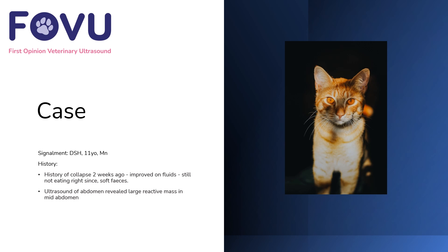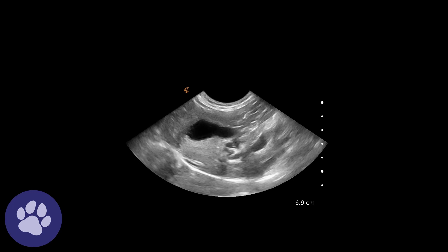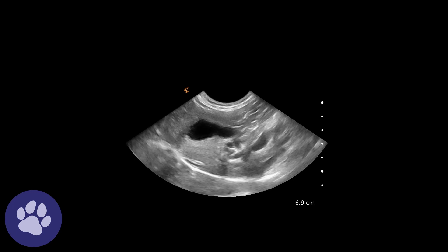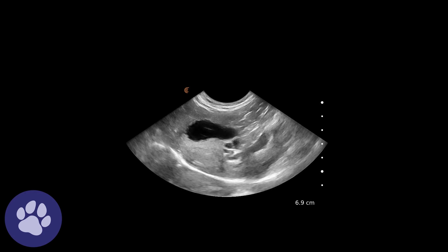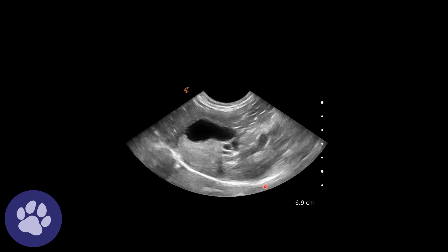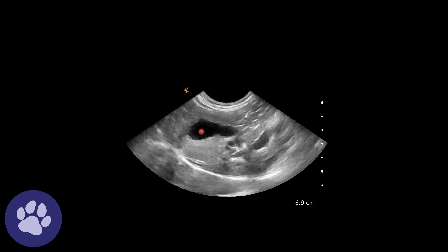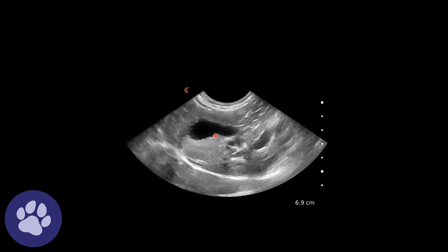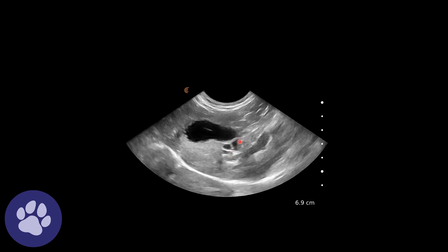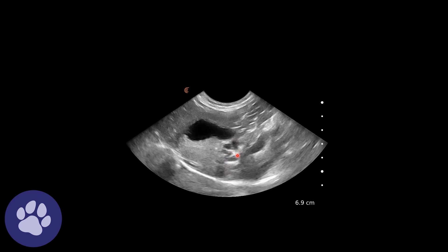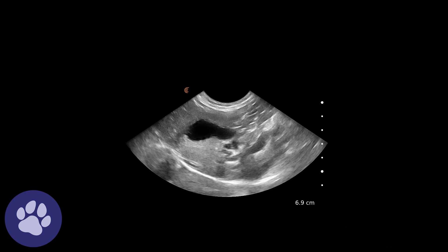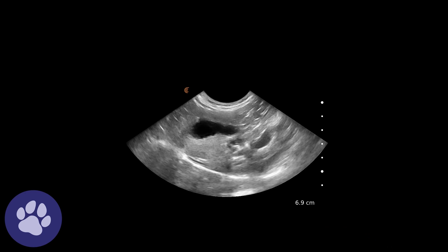Let's have a look at some images from this case. First of all, we found the liver here. We've got the diaphragm down here, we've got the liver, and then we've got the gallbladder with its irregular wall here. There's also some evidence of possible tortuous bile ducts down here. We'd need to put Doppler on to be sure that they are bile ducts.